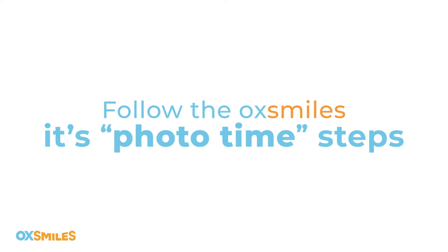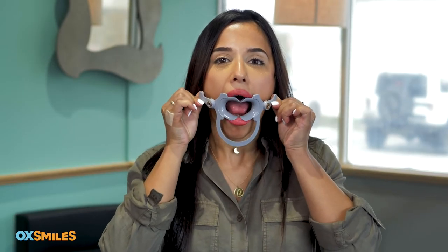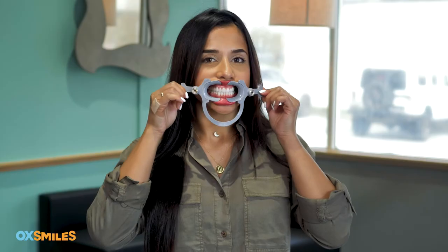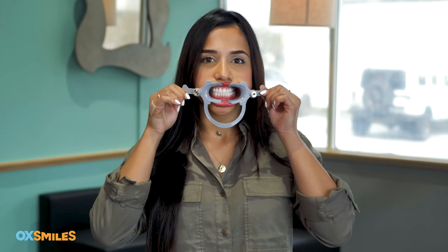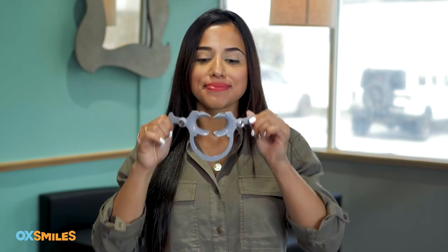Once you've sent us your impressions, follow the OX Smiles 'It's Photo Time' steps and take five selfies of your teeth. Use the smile stretcher from your impression kit to take detailed photos. Capture both the front and the back of your teeth in every photo, making sure you get the front and both sides of your mouth. Tilt your head back and forth to allow complete visibility of the back teeth.